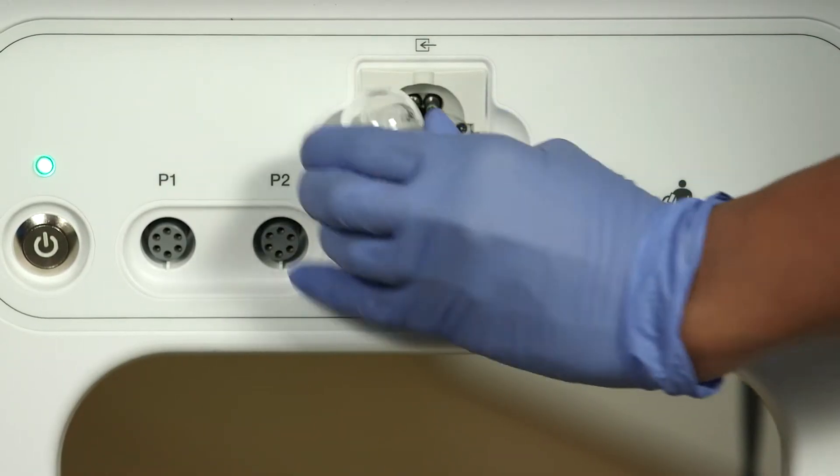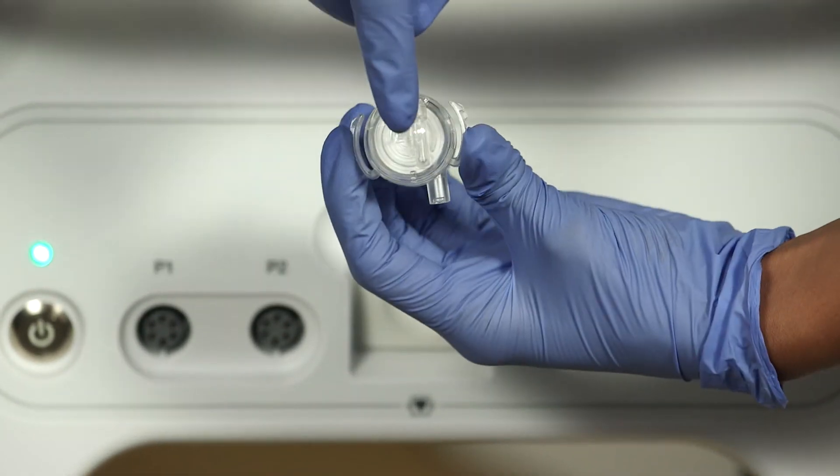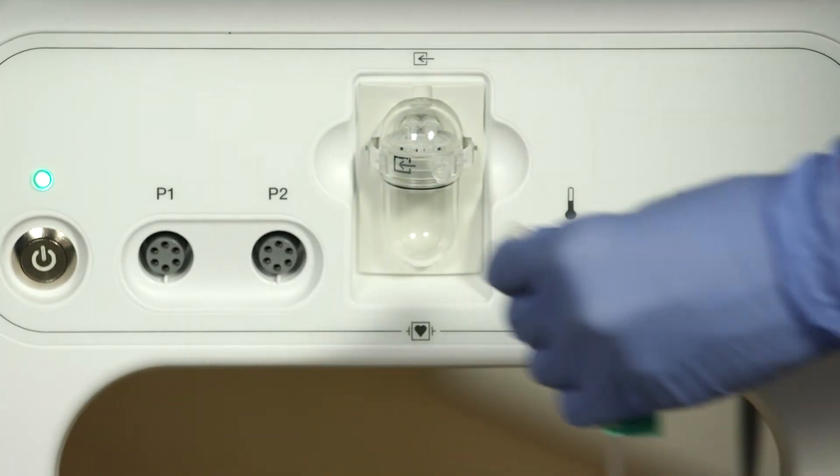It is important to check the water trap before attaching it to the patient. Make sure there is no fluid in the water trap and check the filter on top to make sure it is still white. Change it out if there is any fluid or if the filter has changed color.